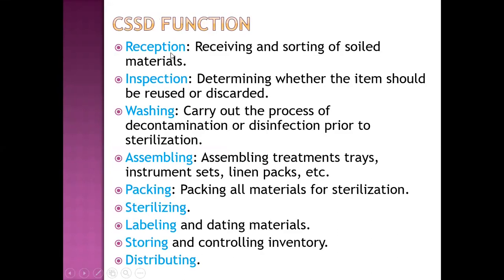CSSD functions include reception, that is receiving and sorting of soiled material, inspection, determining whether the item should be reused or discarded, washing, carrying out the process of decontamination or disinfection prior to sterilization, assembling treatment trays, instrument sets, linen packs, etc., packing all materials for sterilization, and sterilization process, followed by labeling and dating materials, storing and controlling inventory, and distribution. These are the functions of CSSD.